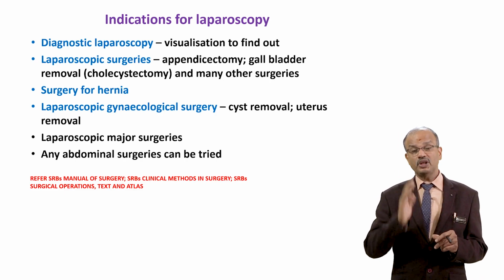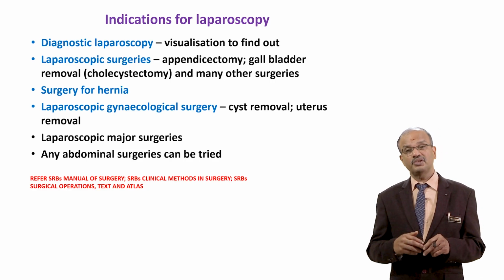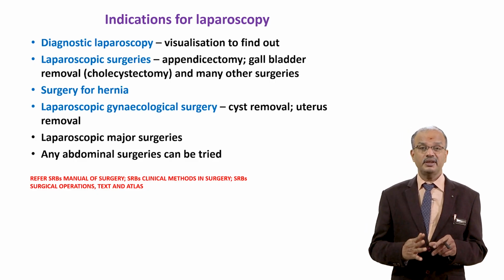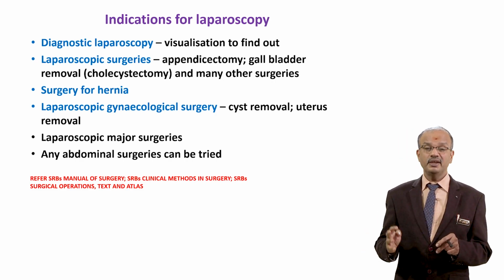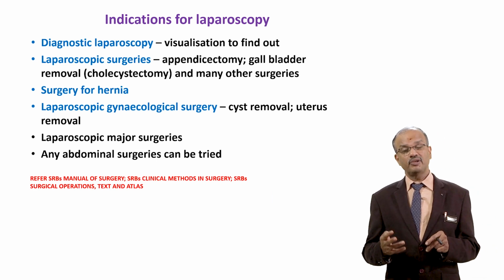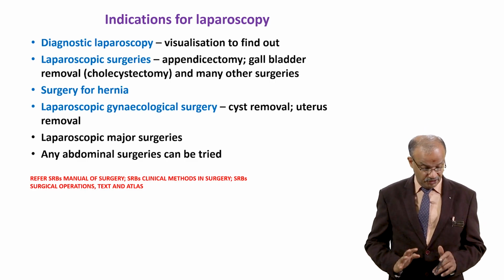Remember, conversion is not a failure, it's a decision. When you find it difficult and can't go ahead with the laparoscopic surgery, immediately think of conversion and do a proper surgery. Finally, at the end of the day, patient safety and concluding the surgery are most important. If these two are compromised, we cannot go ahead. If you find it difficult, call somebody else. If they also find it difficult, your team is finding it difficult, straight away convert and finish the procedure, do a proper job. The safety of the patient is the most important.